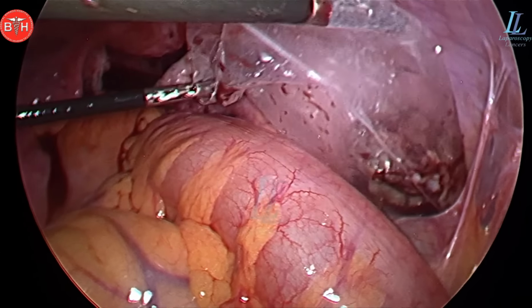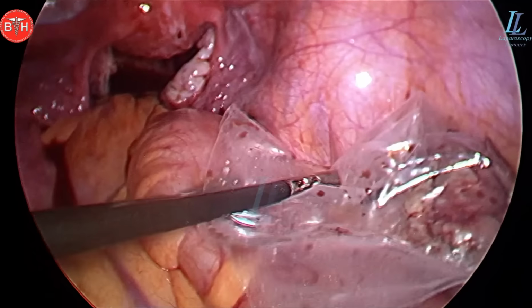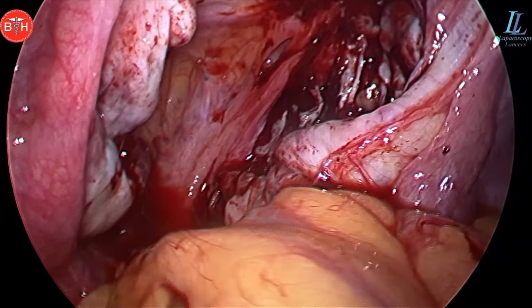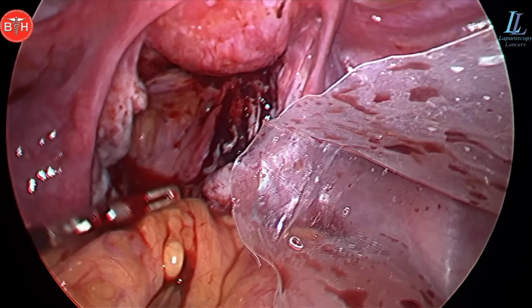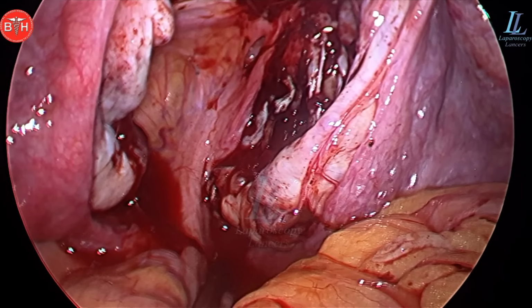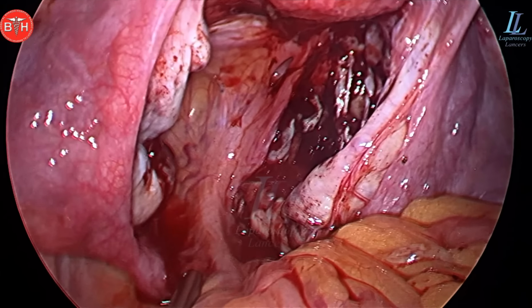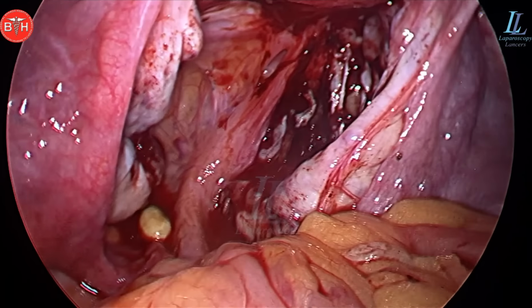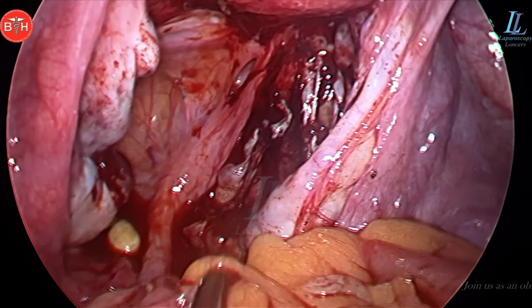And I'll be dilating the left lower port, that is just above the anterior superior iliac spine, into a 10 millimeter port, so that gallbladder grasper comes in and the specimen can be taken out. So the surgery is almost complete. Only the formalities remaining, just a bit of suction, that is all required.